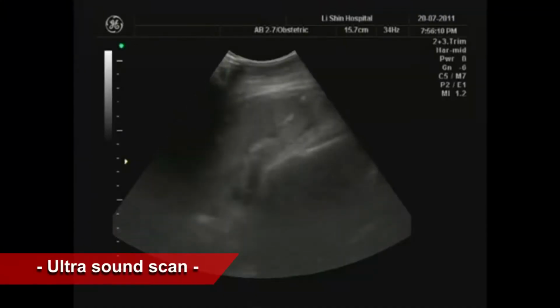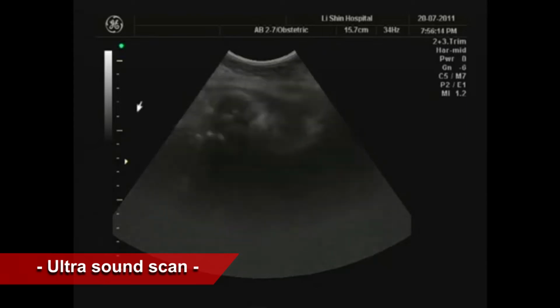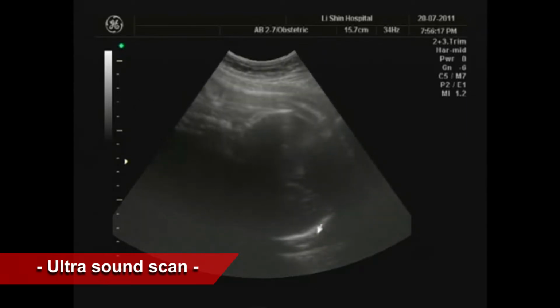Whenever a lady becomes pregnant, she has to consult a gynecologist. She has to report to the hospital, where she will have her preliminary investigations and examinations. Another investigation that is of utmost importance is the ultrasound scan. Ultrasound scan has its uses at various stages in pregnancy.